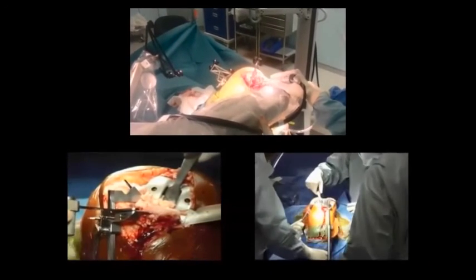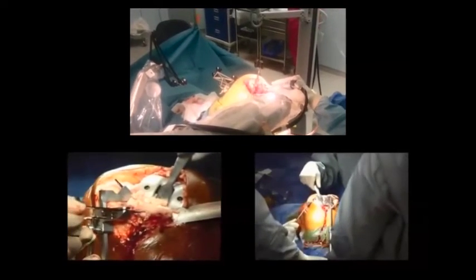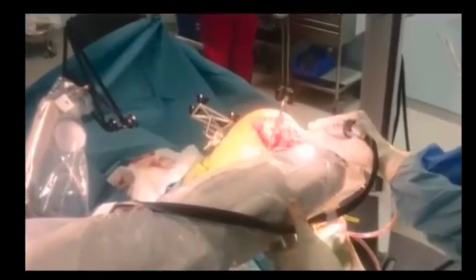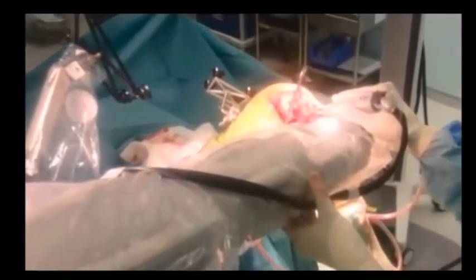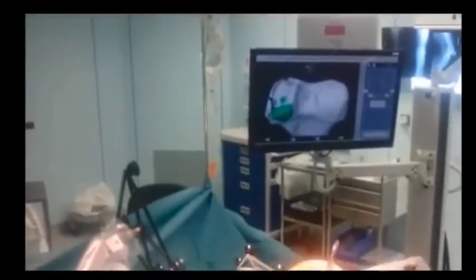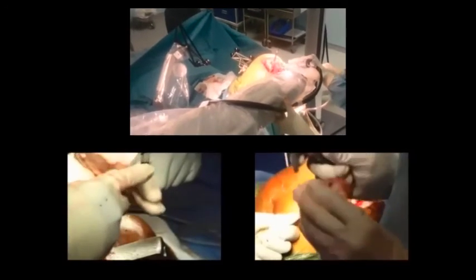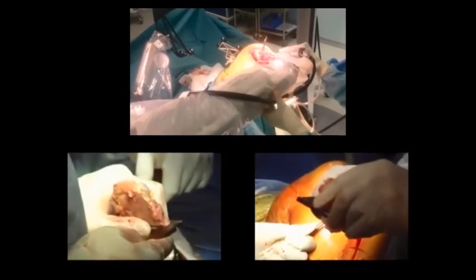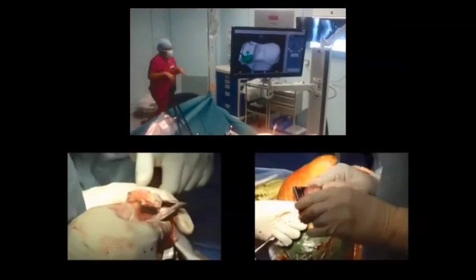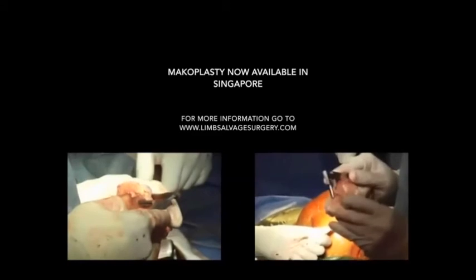Here below we are now cutting the tibia. In general — and this is open to variation — most surgeons in traditional knee replacements will do the femur first and then the tibia, whereas with the Makoplasty in general you want to do the tibia before the femur. Here below I am measuring the cut to get an estimate of what the axis will be, whereas with the Makoplasty that's computed and it's not open to error.